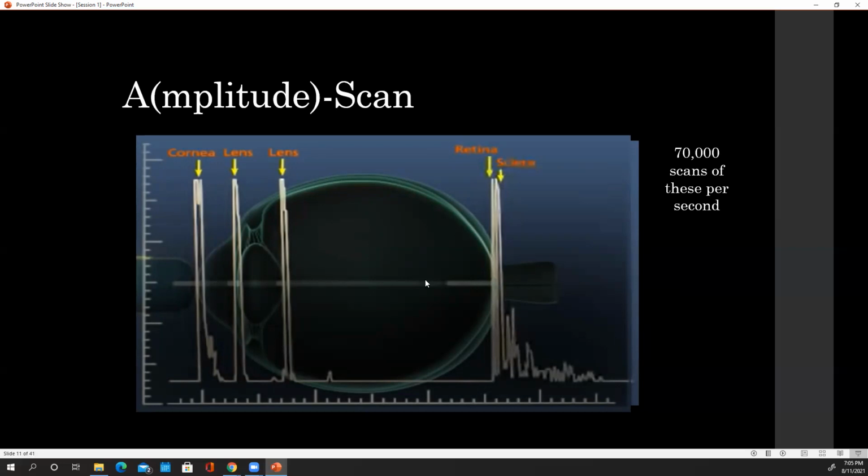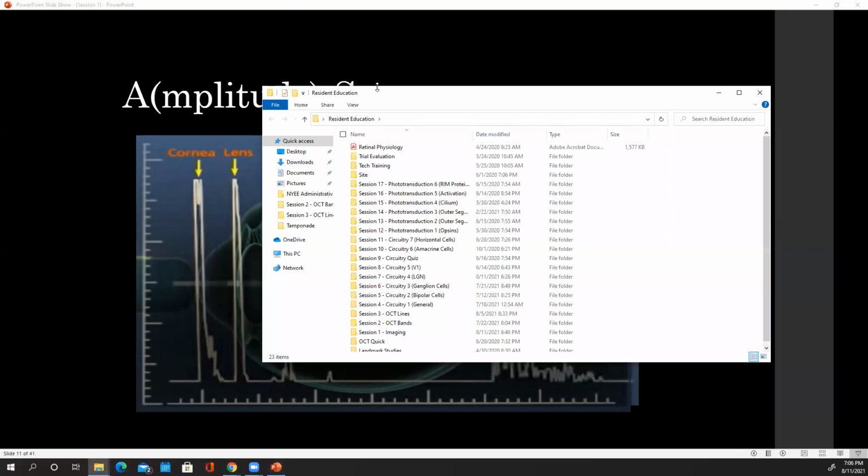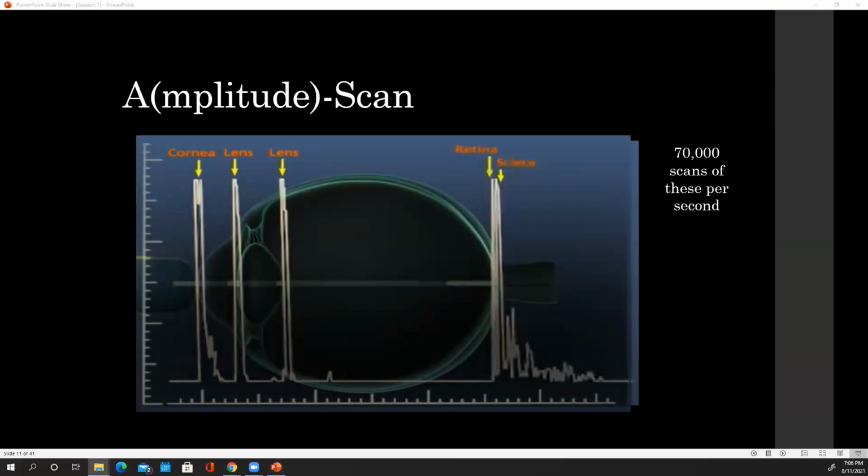The light goes through and it actually bounces. And actually, let me just see, Giselle. I actually have seen an A scan. So this is one of the tools that we use when we're doing ultrasounds and we're determining if there's a retinal detachment, right? We put that A scan over it to see if it spikes the same way. Well, exactly. But you have an A scan that's overlaying what you guys call a B scan, right? Right. And so that's what we have.